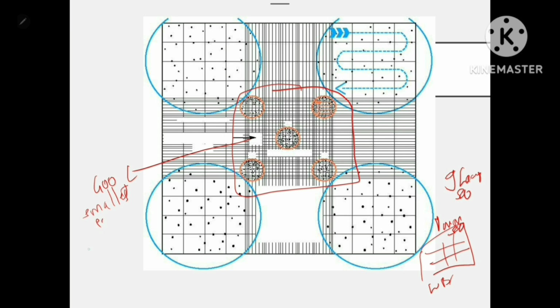Each small square is around 0.050 mm square. By marking each fifth vertical and horizontal line with a double line, the smallest squares have been segregated into 25 groups of 16 squares. As I said, this will be the counting area.